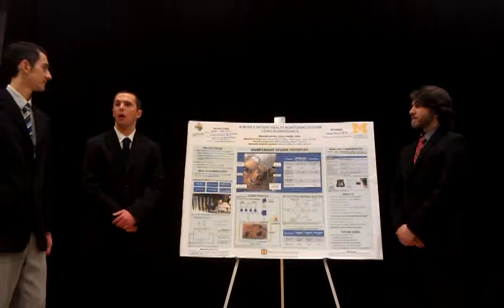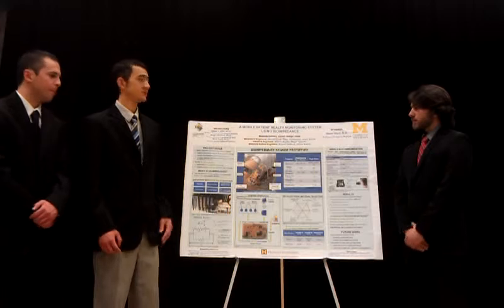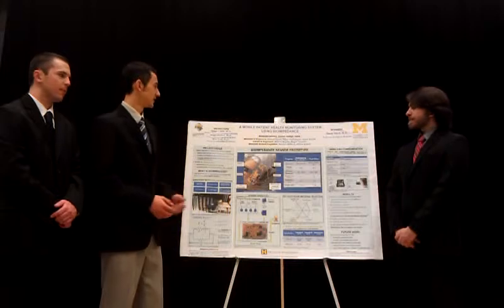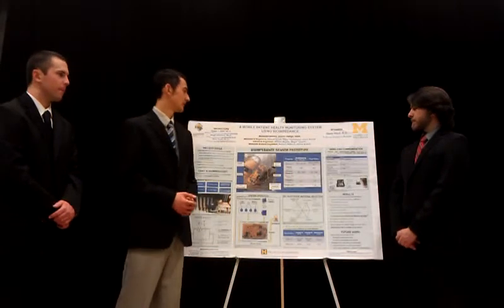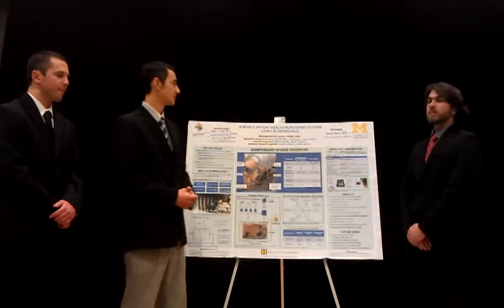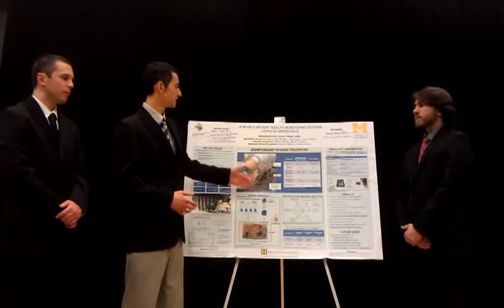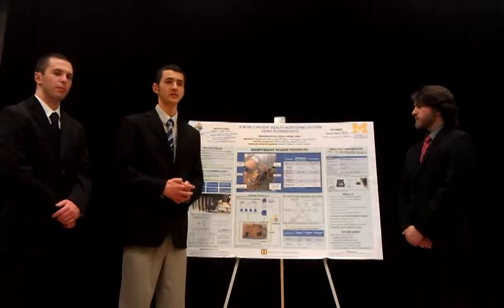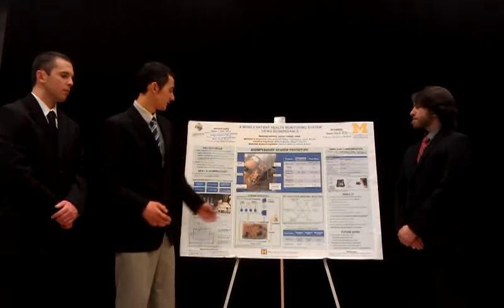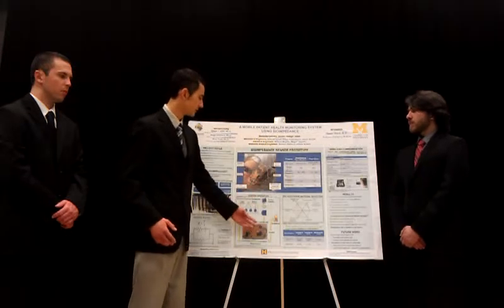Now Tim's going to talk about our sensor design. This picture shows the first mobile solution for health monitoring using bioimpedance science that we designed and implemented. This table shows engineering specifications that we targeted as well as final values. The size of this device is 3.5 by 3.5 by 5 inches, and the weight is 625 grams.